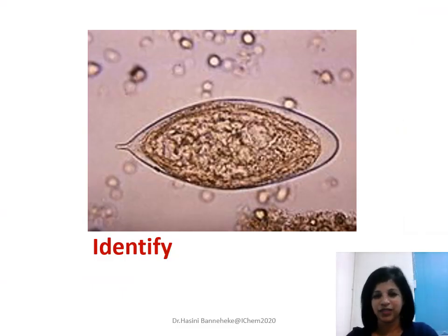So now let's see another structure. Now this is of course not from a stool sample. This is from a urine sample. See whether you can recognize them. Now these are not present in Sri Lanka. In fact, if at all, we see patients returning from the Middle East or maybe from the African side, these cases may be reported, but otherwise this disease is not prevalent in Sri Lanka.